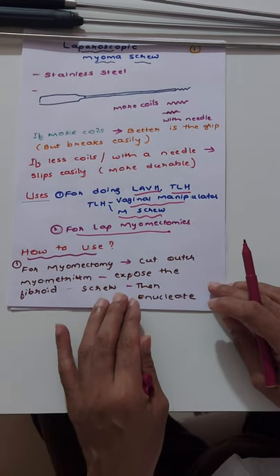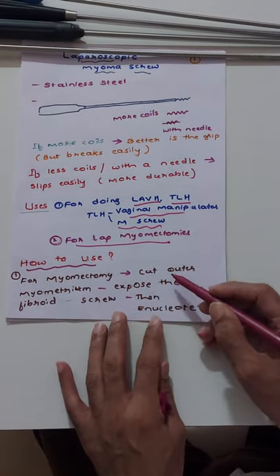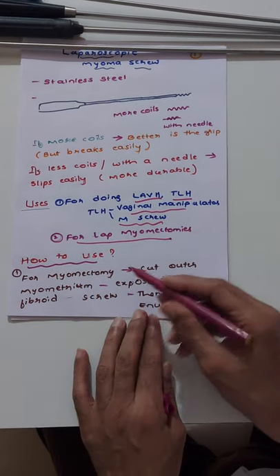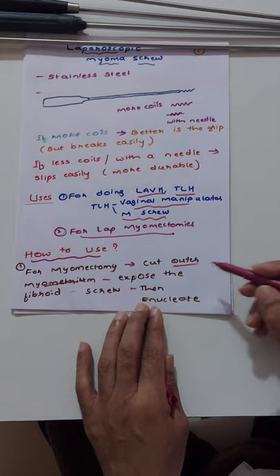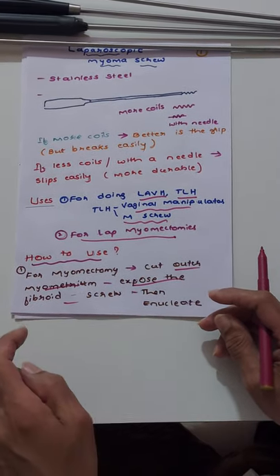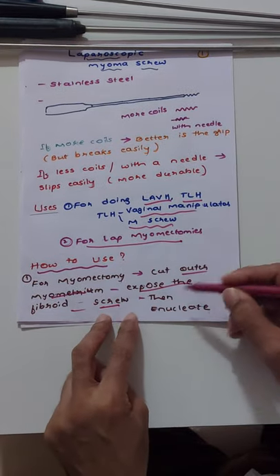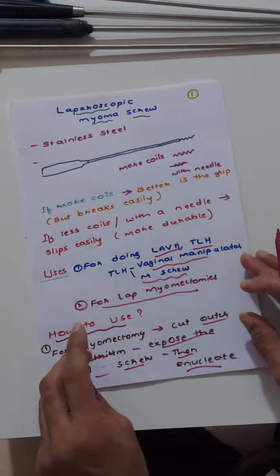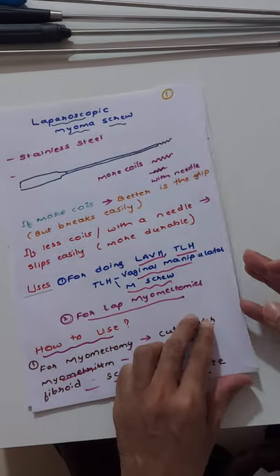For laparoscopic myomectomy, first you locate the fibroid, cut the myometrium, and expose the fibroid. Then screw the myoma screw into the fibroid, and then you can do the enucleation.